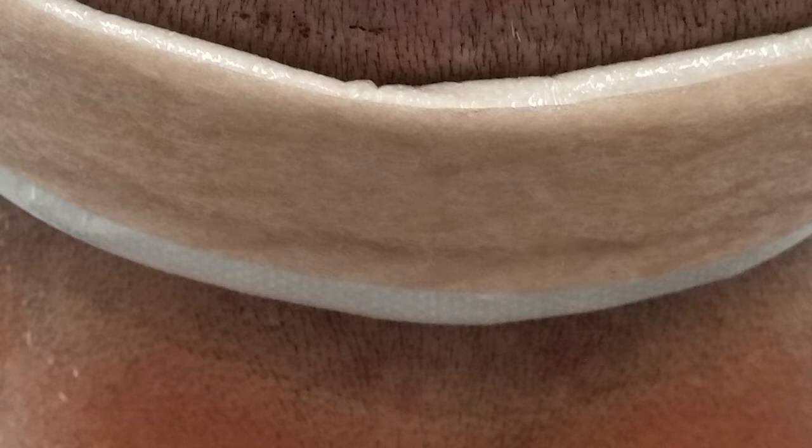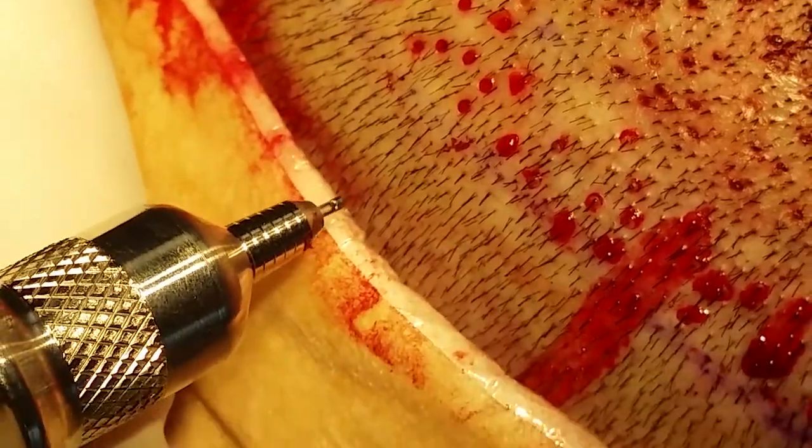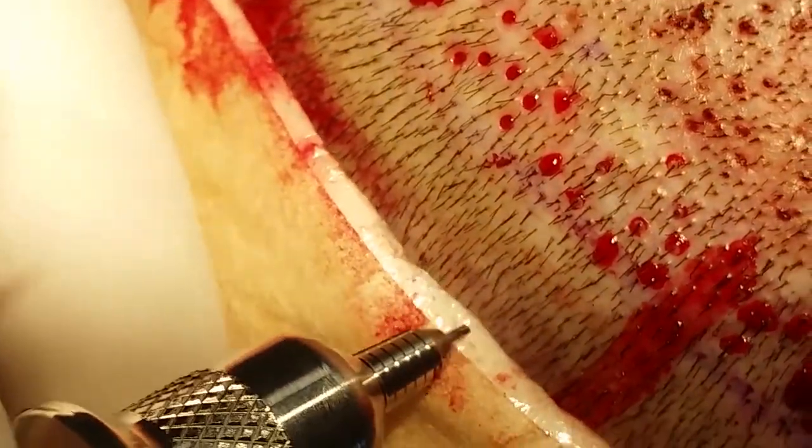You must be careful to avoid catching a rotating punch with a serrated tip, particularly on the 12-ply gauze. If you do grab the tip with a 12-ply sponge, you should stop the machine and rotation as quickly as you can. The window aspect of the window punch can also catch a loose edge of a 12-ply sponge. For this reason, it is often advisable to use a Telfa sponge instead to absorb any blood or fluids in the donor area. The Telfa sponge will not catch the rotating window. Telfa sponges are particularly valuable if you have a little blood in the rotating window and you wish to clean the sponge while the punch is rotating. You can also stop the rotation of the punch and then clean the punch through a variety of means.